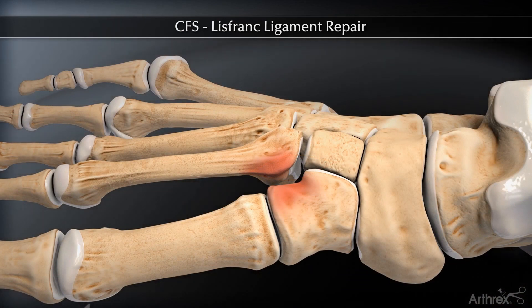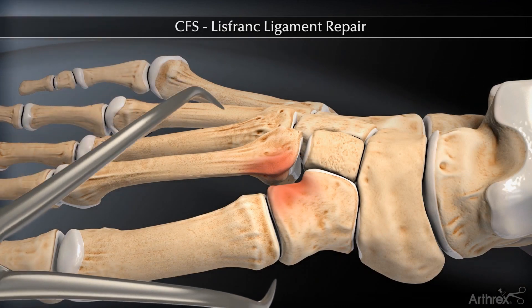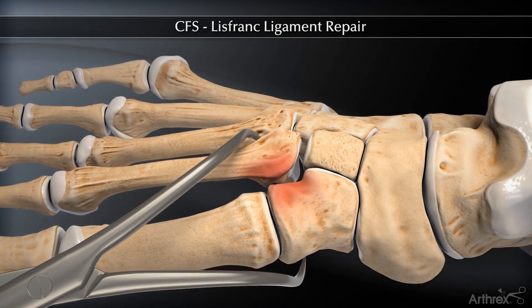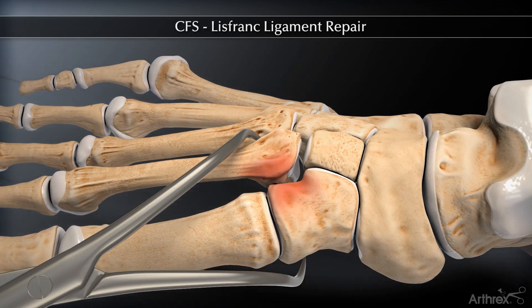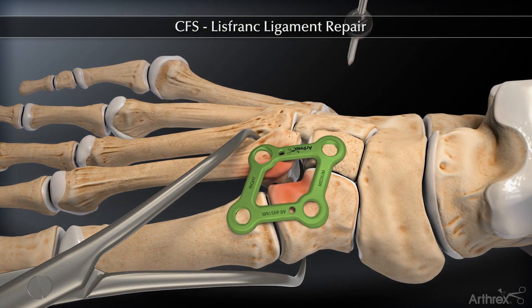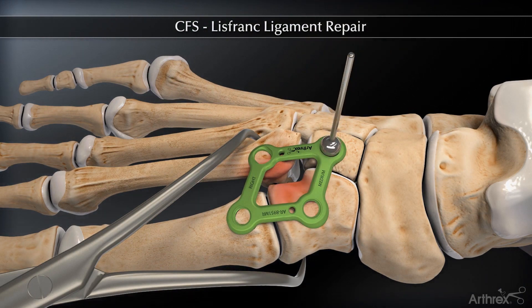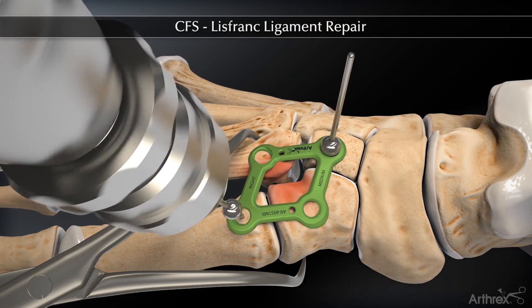The instability of the Lisfranck joint is easily visualized. Once the joint is cleaned out, a bone reduction forcep is used to reduce the dislocation. Once manual reduction is achieved and visualized under C-Arm, the appropriate sized plate is placed over the first and second TMT joint with the oblong compression hole over the base of the second metatarsal and temporarily fixated with BB-TACs.